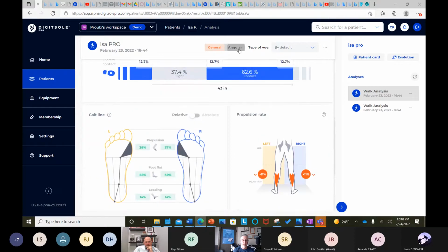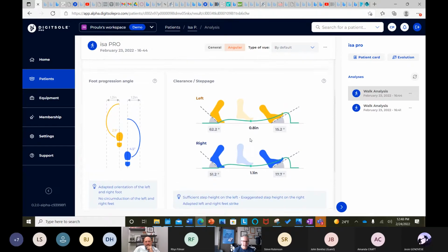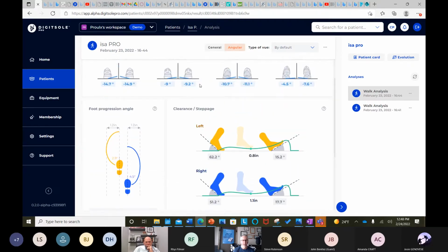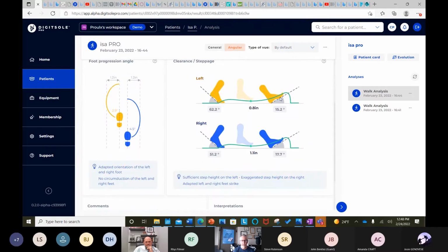And then let's go ahead and look at this guy right here. Angulation, fairly normal. But what you see is relatively low angulation here. I've got another little guy that I show too. And what's interesting is they don't normally walk on treadmills, right? Maybe some adults use treadmills. So it does throw them off a little bit, so let them walk a little bit before you actually test them.